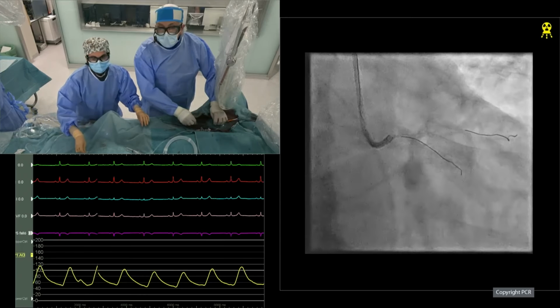I think it's sometimes hard to predict, and what we hope is that we'll get time to see that final OCT image, and we'll see how much eccentricity there is, and if there's any unintended deformation. It'll be really interesting. And just concentrate on LAD and circ. Now they fenestrated the LAD with a big balloon, so now you should kiss.